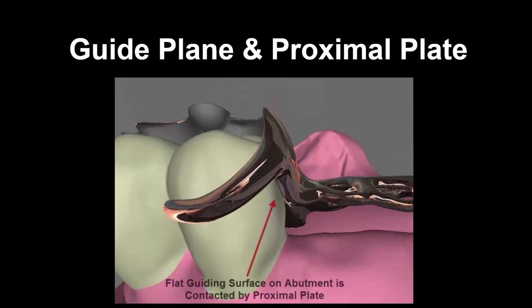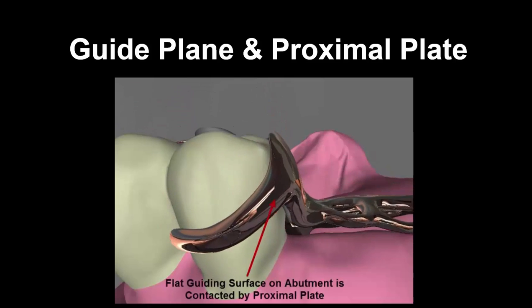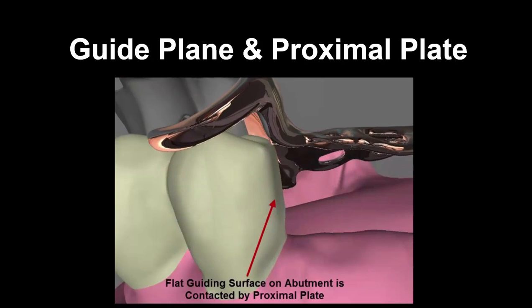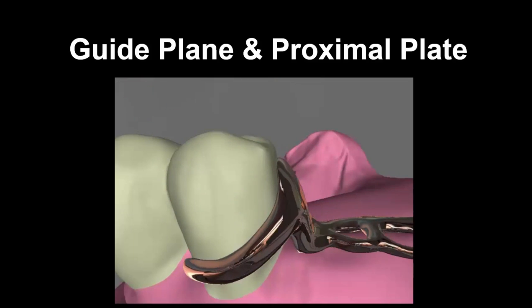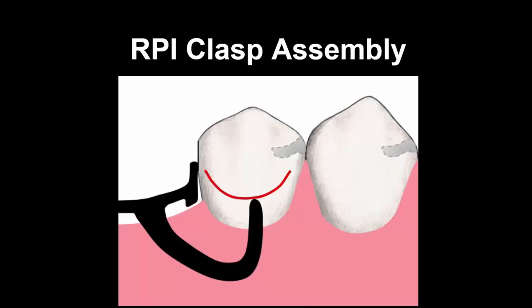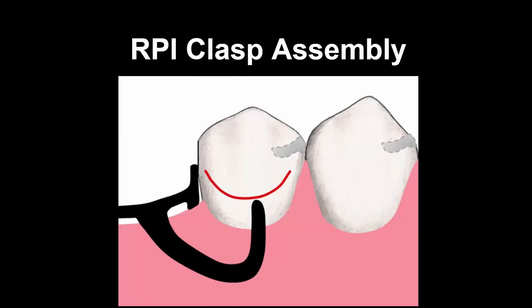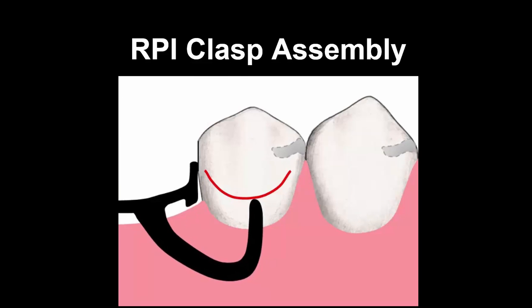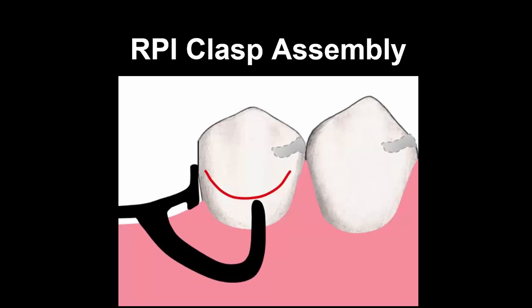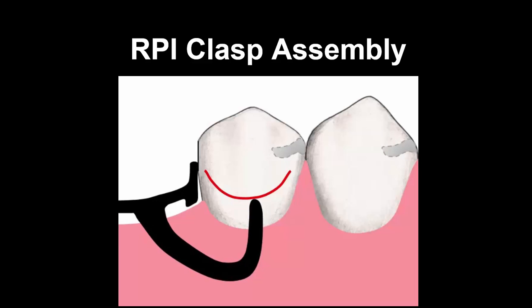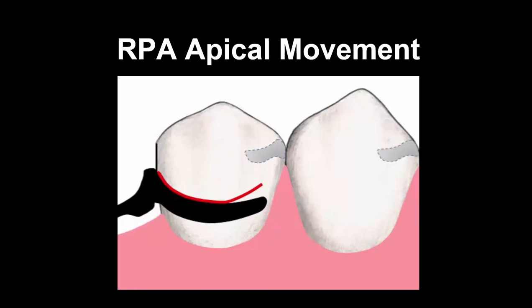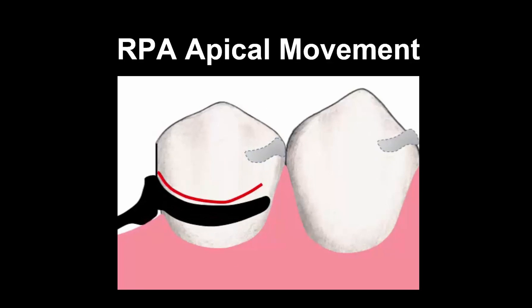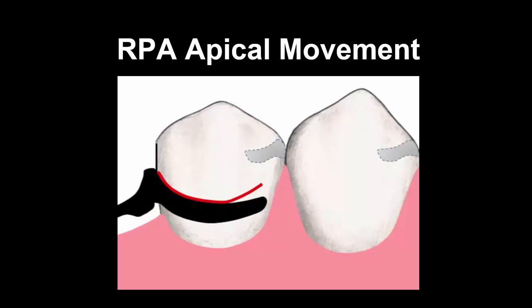You can see a guide plane with the proximal plate portion of the framework contacting that guiding plane and guiding the removable partial denture into place. There are many clasp assemblies that animations have been created to show how those particular assemblies function and the various components compared to the red survey line. Here we can see an RPA where the entire clasp assembly is located apical to the survey line.